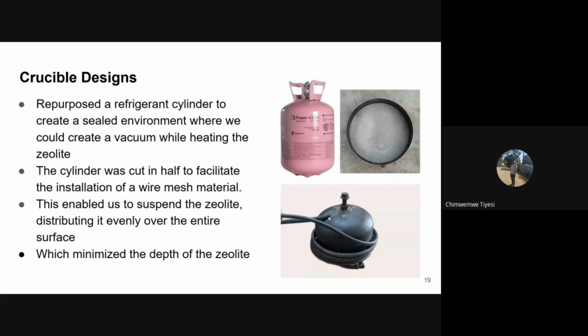Lastly, we installed a 14mm threaded access port at the top with a bolt installed and a high temperature washer to prevent any leakages, and this also provided a tight seal. In this configuration, zeolite was poured into the crucible before regenerating by using a funnel.